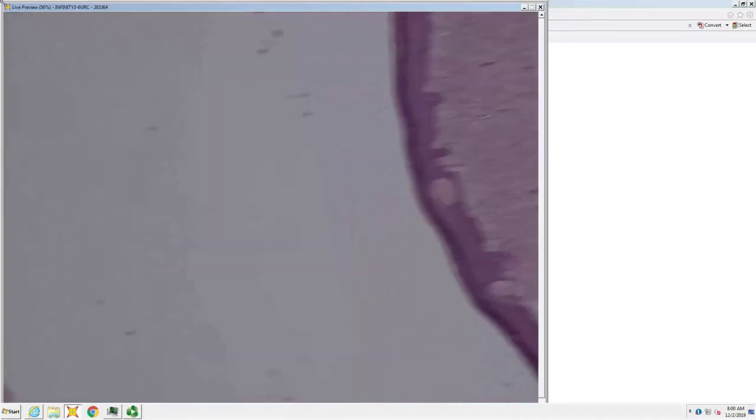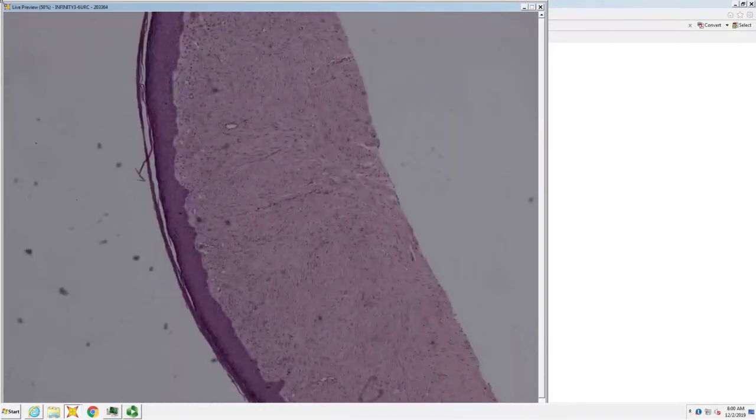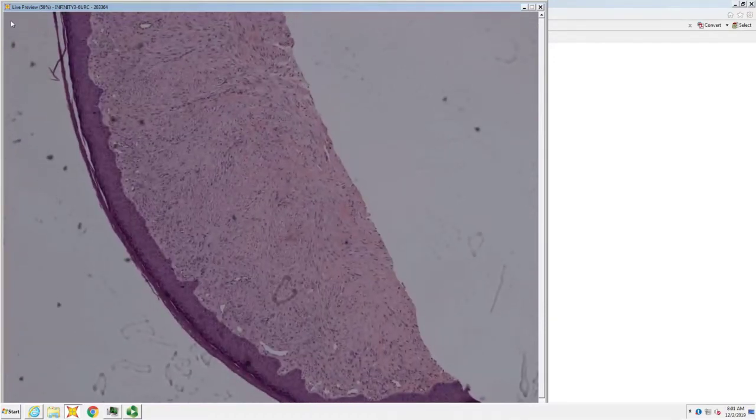Epidermis looks acanthotic to me. Yep. I think this is acanthotic, and where do you think you might be? Acral skin. Probably acral skin, and you got something with a kind of crisscross fascicle pattern, going in a crisscross pattern on acral skin. Acquired digital fibrokeratoma. Very good. Not acquired digital, you're thinking the right thing. Oh, your lips just said the wrong one.